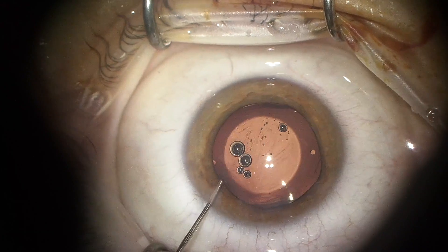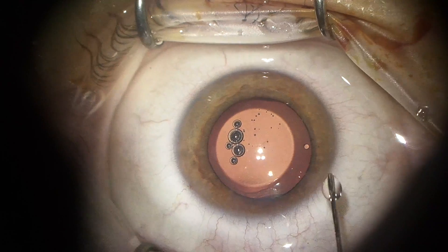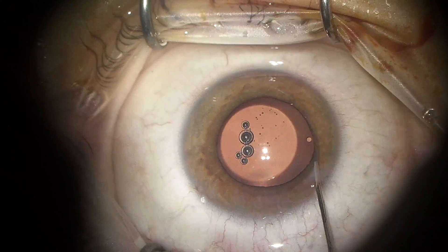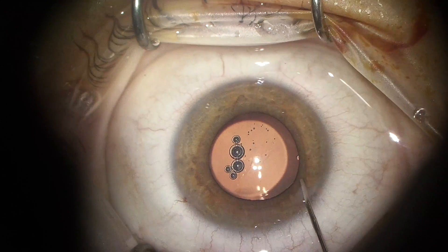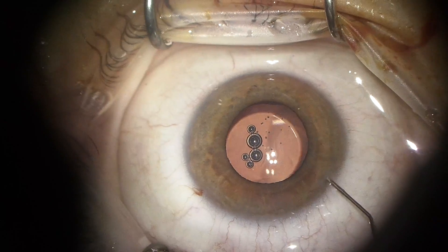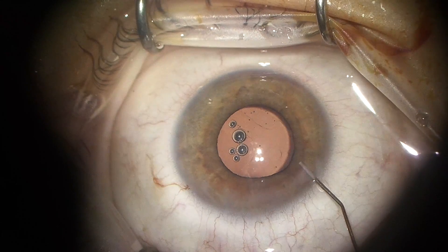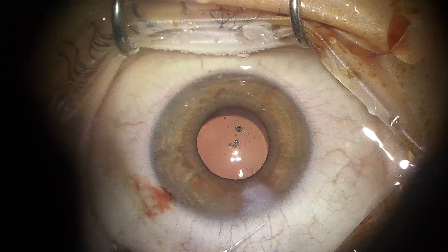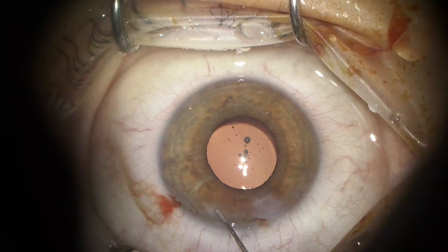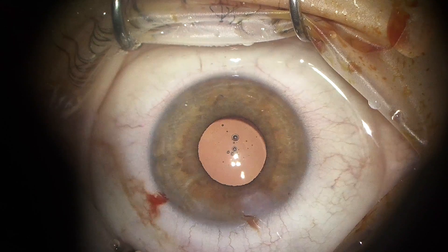This next solution I'm using is to shrink the pupil to maintain the implant's position behind the iris. As I was injecting it there are some more bubbles, so I'll finish injecting the solution and get the pupil to an adequate size before removing the bubbles in the same manner as before. Those little bubbles that remain won't be a problem — they'll be gone within a few hours. I'm just finishing hydrating the wounds, making sure all the incisions are sealed, and it looks beautiful.